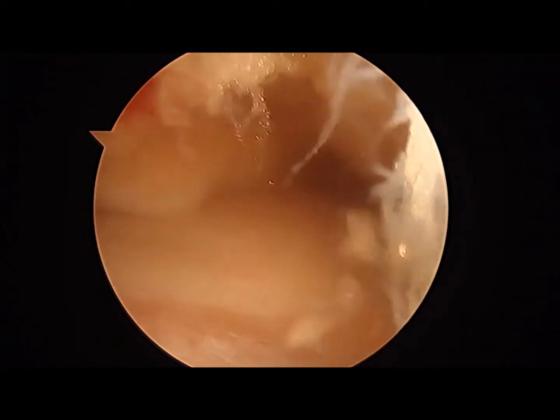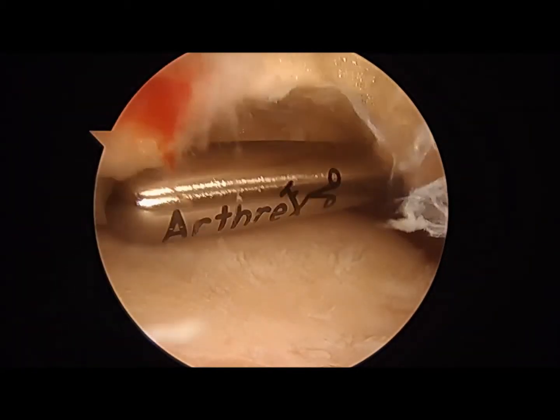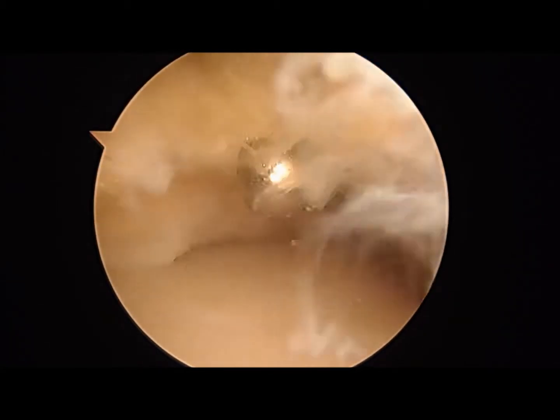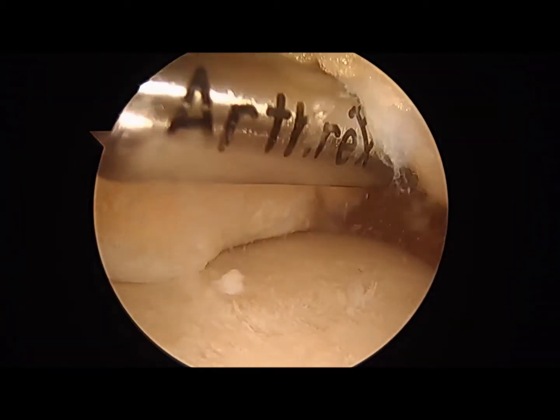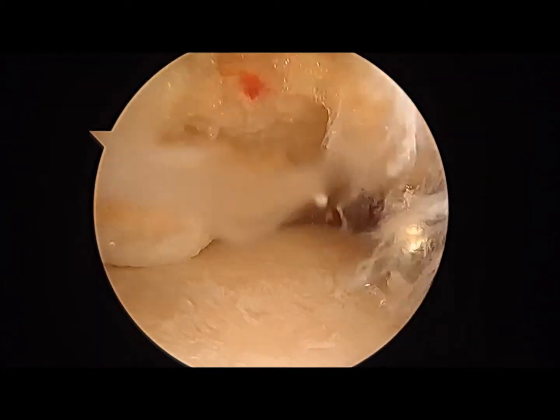Okay, everything looks good. Clean out. The anterior osteophytes noted before in the picture are gone. We'll go ahead and clean all the junk out of here.